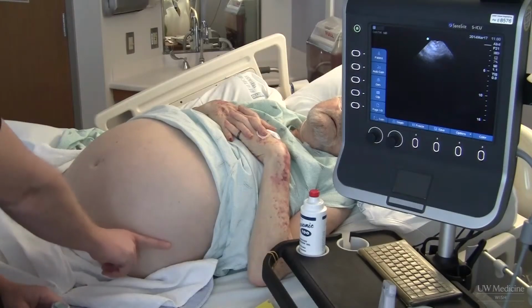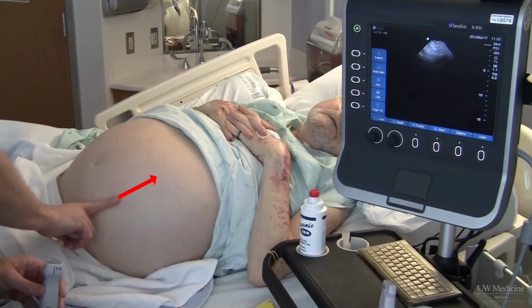When performing paracentesis, the left lower quadrant is often preferred due to a thinner abdominal wall in this region, less risk of surgical scar or adhesion, and the possible presence of a gas-filled cecum on the right. Identify the spleen and the lateral rectus sheath, along the edge of which run the inferior epigastric arteries. On the patient's right, identify the liver and lateral rectus sheath.